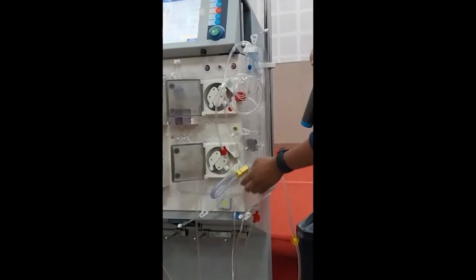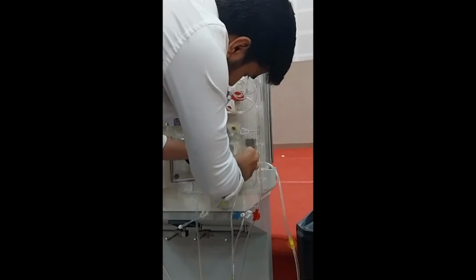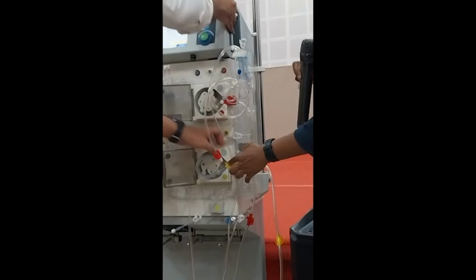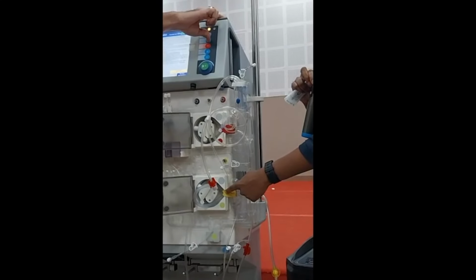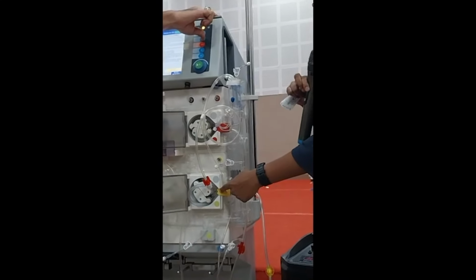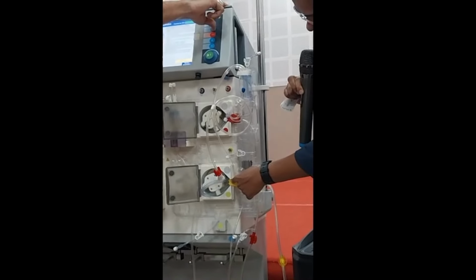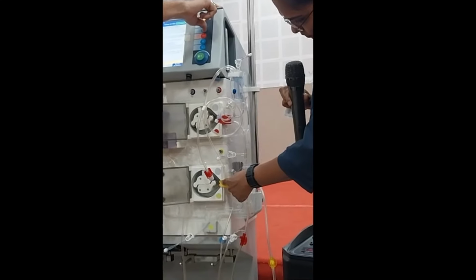So one pump has been adjusted, and now the second effluent line is also being fitted in. Press the reset button and we can see that this tubing too has been set perfectly.